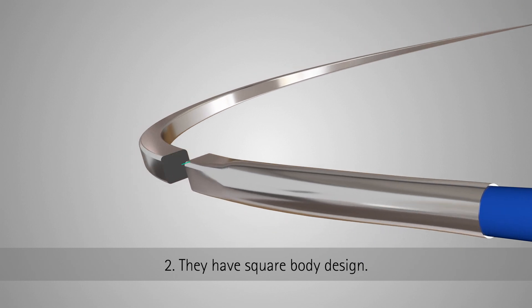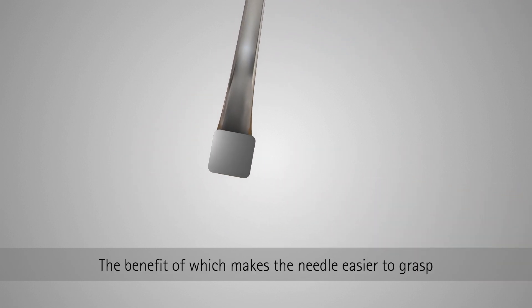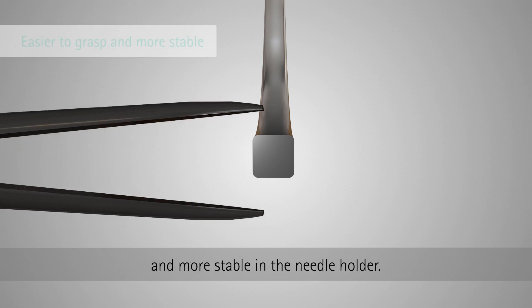Two: they have a square body design, the benefit of which makes the needle easier to grasp and more stable in the needle holder.